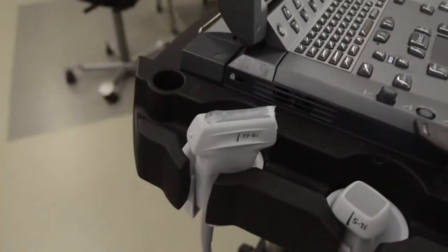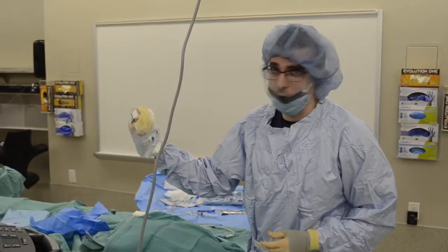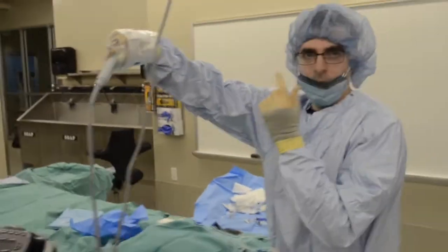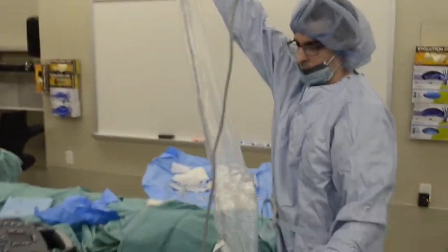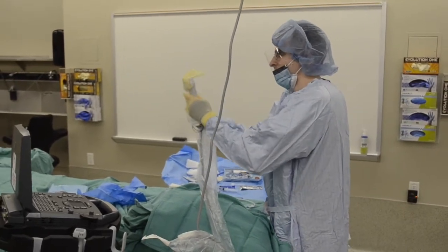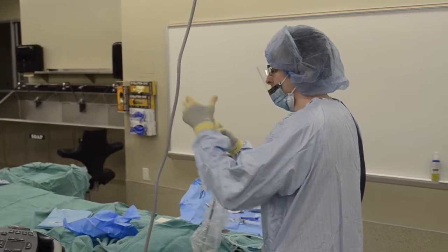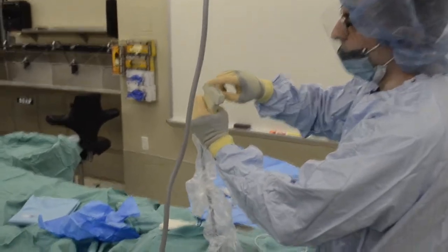Alright. So I'm going to reach down and grab the probe, being careful not to touch the machine with my arm. Now that I have the probe, I'm going to pull this down myself. And everything that comes off the field is no longer sterile. So you want to make sure there's no air bubbles here, so you get a nice clean view.